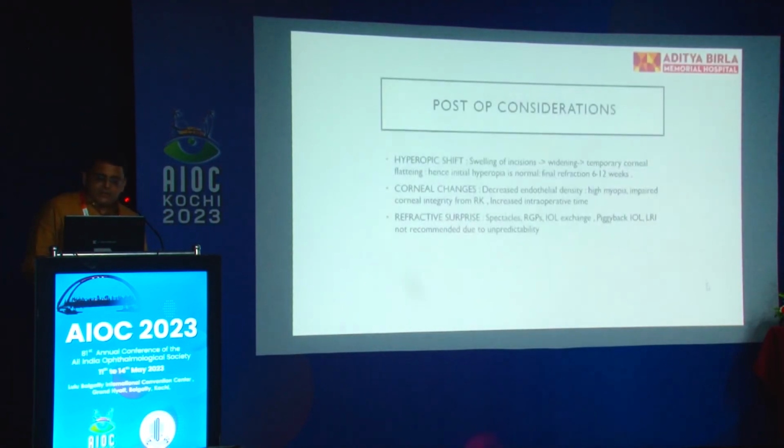Regarding the choice of IOL, it is important to understand that multifocals would have unpredictable outcomes. So what we can plan is a monofocal, a toric monofocal, EDOF or a toric EDOF in such cases with wonderful outcomes. Post-op consideration: initially there would be a hyperopic shift because of swelling of the incision, which might last for about 6 to 12 weeks.